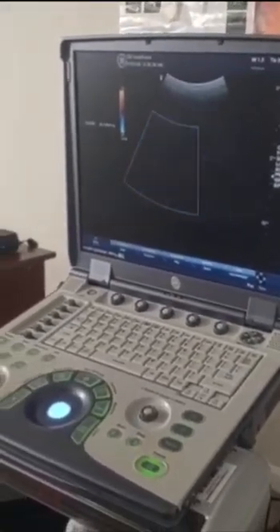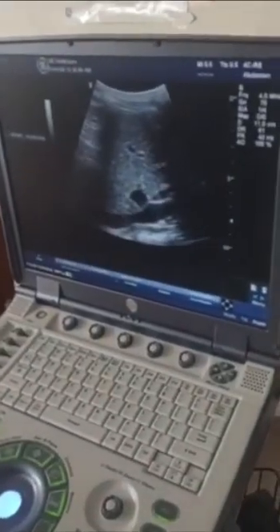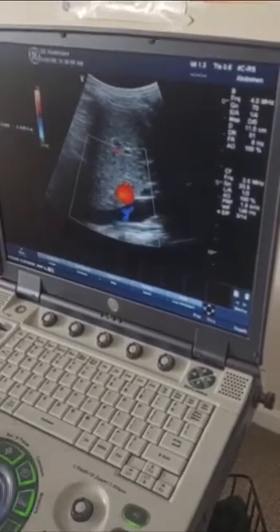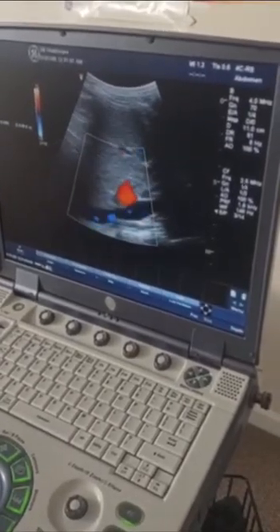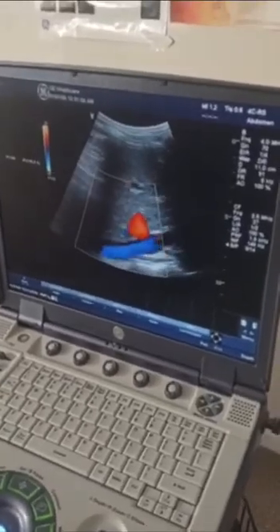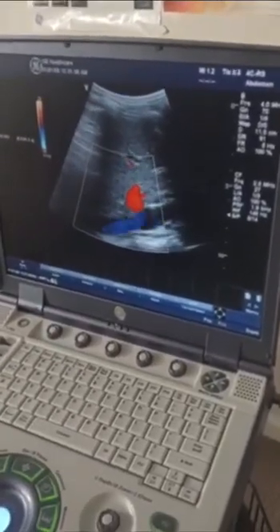Now I'm going to go ahead and use the flank approach, which is trying to get it using a subcostal approach. You have your liver, your right lobe there, and I'm going to have them take a deep breath in and hold it — deep breath all the way in. I'm going to put color on that view, and you can see the IVC. I'll turn up my color gain there, and you can see your IVC using the side approach.